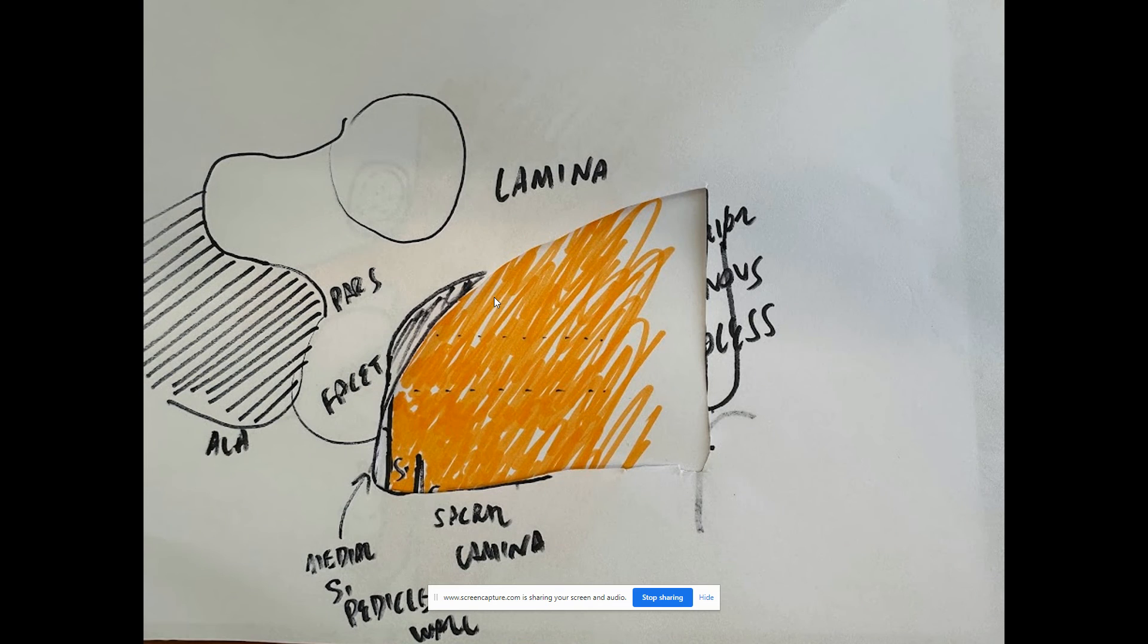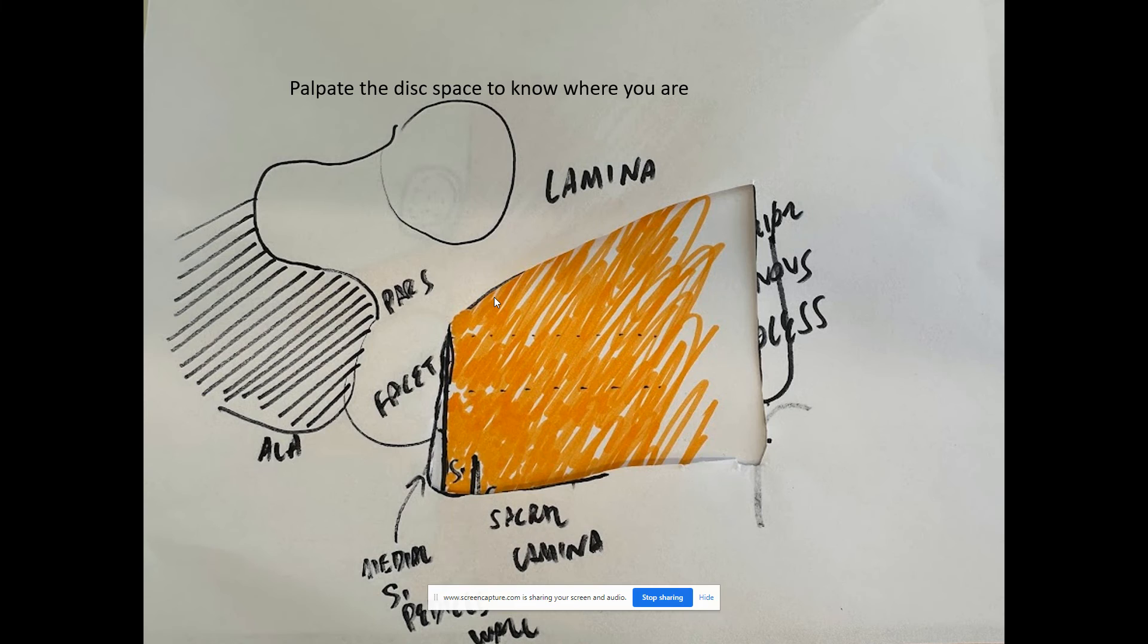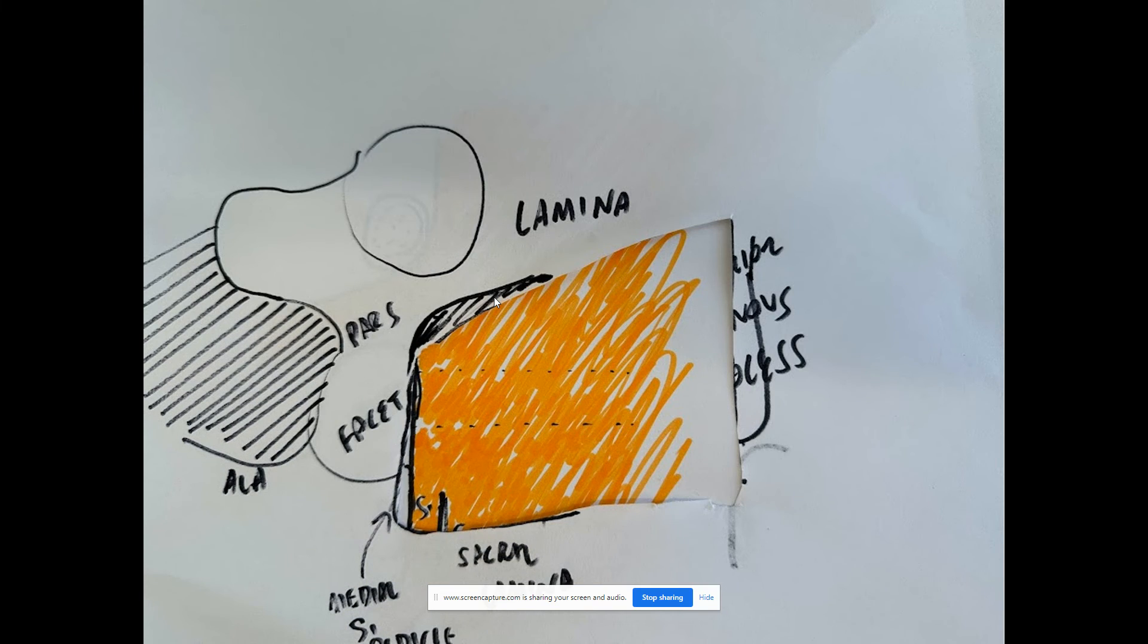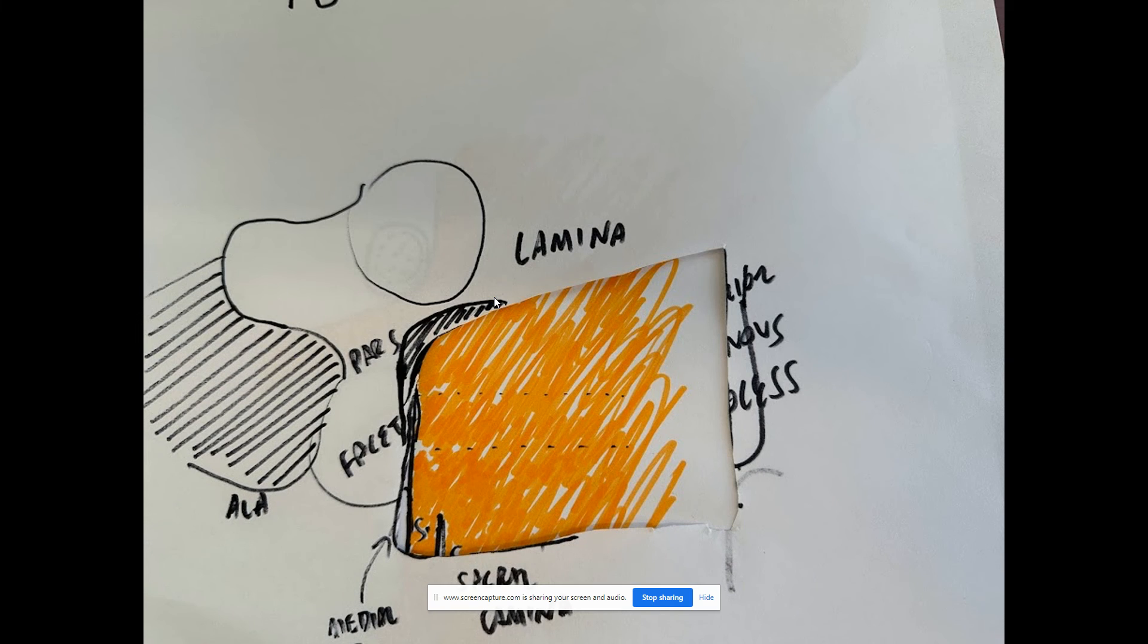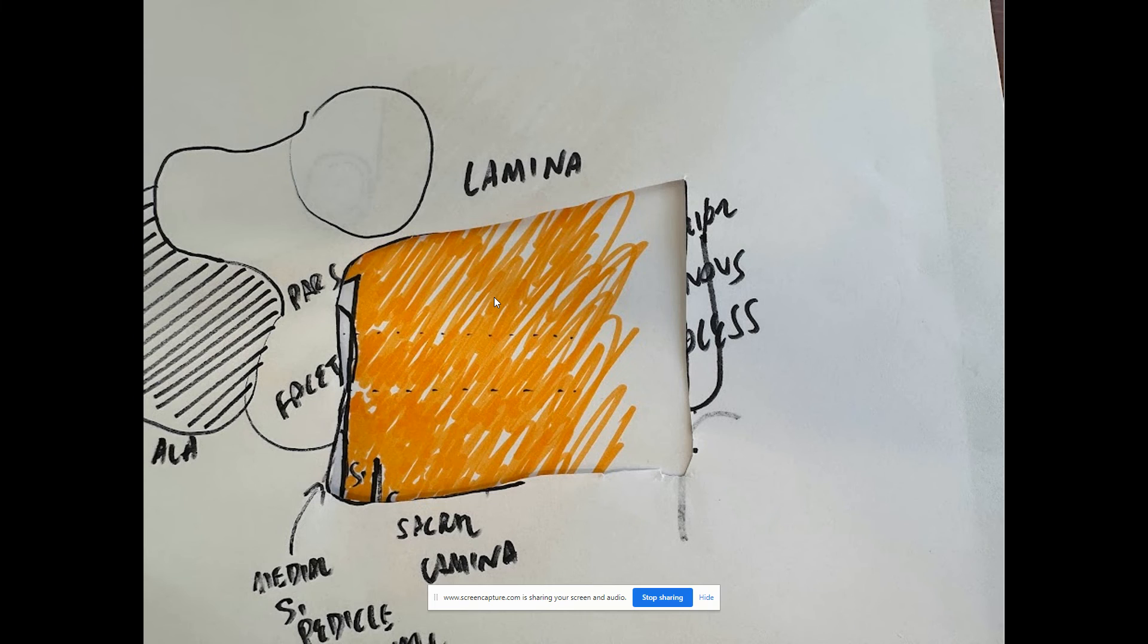You thin going rostral and keep palpating and feeling the disc space so you know where you are. Keep going rostral. At some point you have to go to the opposite side of the table. Keep thinning rostral and going lateral, and then hopefully you can find the axilla of the L5 nerve root where it exits.